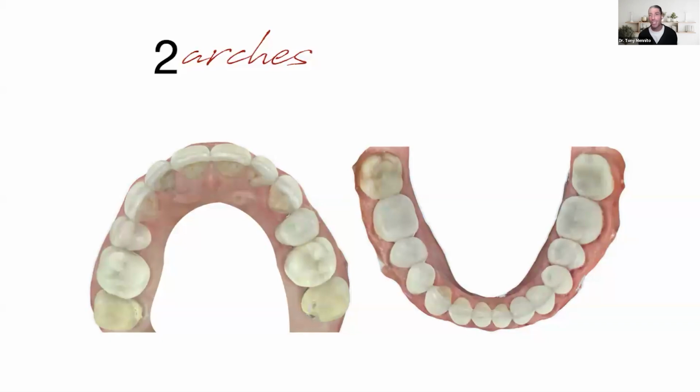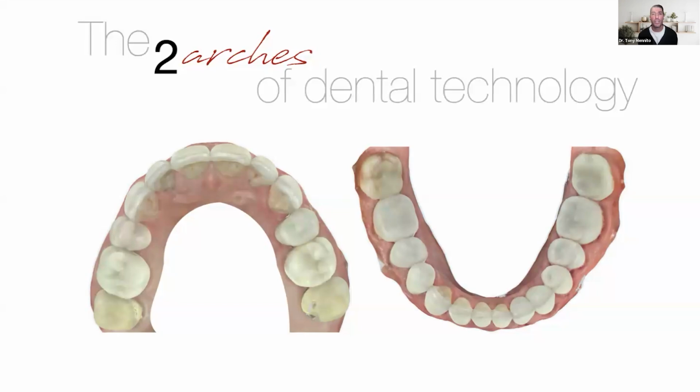Anytime I talk about digital technology, I try to speak in a way that dentists understand, right? We understand two arches, the maxillary and the mandibular arch. So when we're thinking of the two arches of dental technology, the maxillary arch in my mind is data capture. We bring a patient in, they're new to our practice, and we need to capture data on them so that we can diagnose, treatment plan, and then implement that treatment.